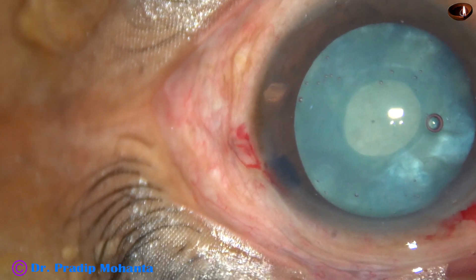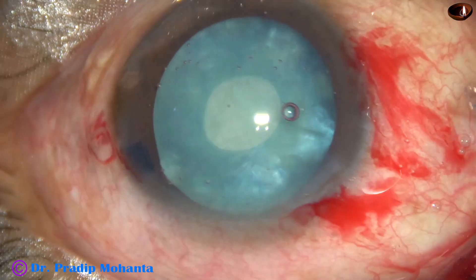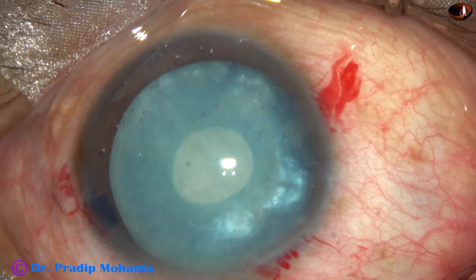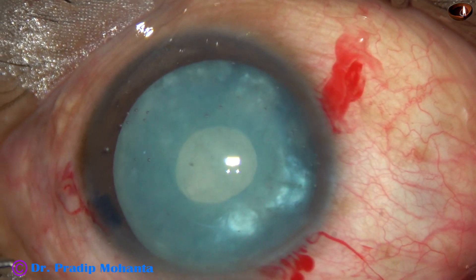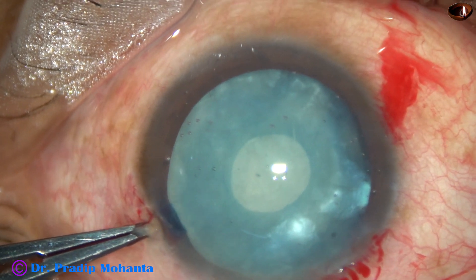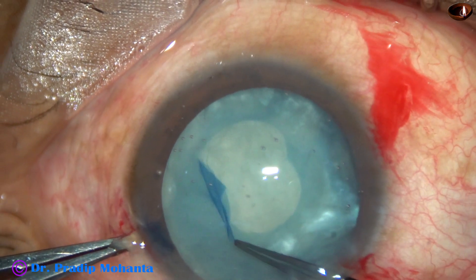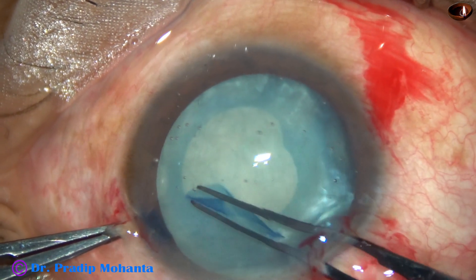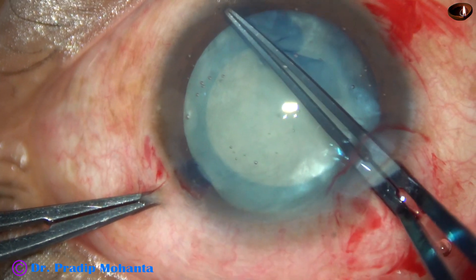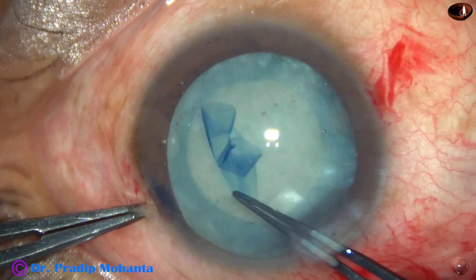And now the intralenticular pressure is on the negative side. 2% HPMC is injected again to fill up the anterior chamber. And now the mini-rhexis is to be converted into an adequate-sized rhexis. A small cut at the margin of this small rhexis. The fixation forceps is taken again and the flap goes anticlockwise all around, coming back to 8 o'clock, and it becomes a continuous curvilinear capsulorhexis.